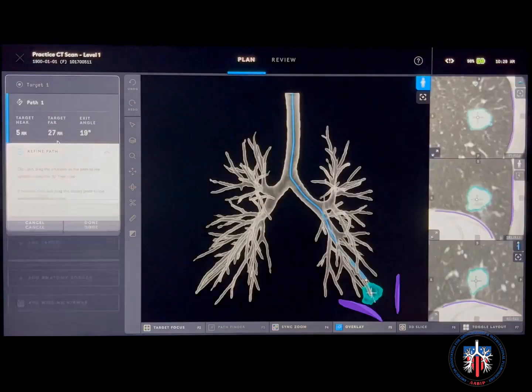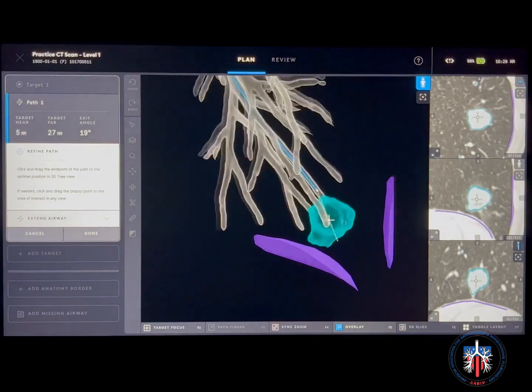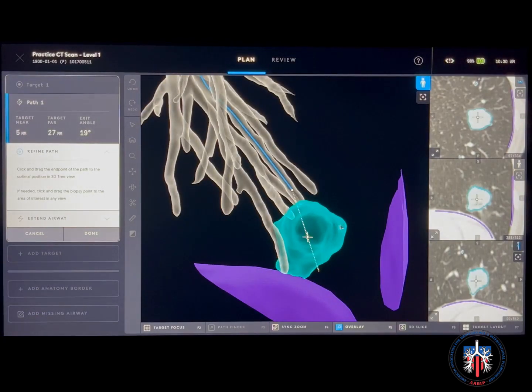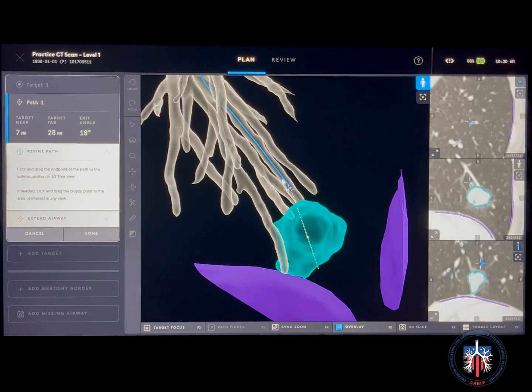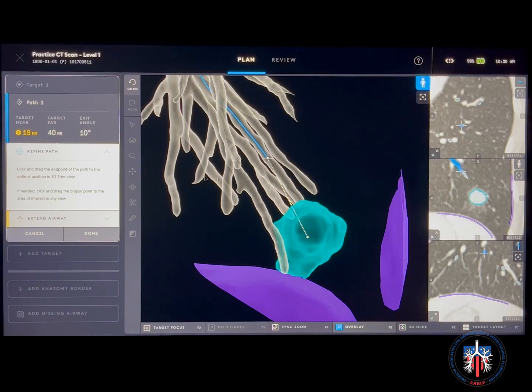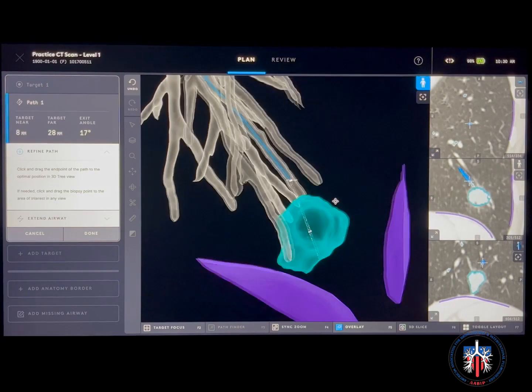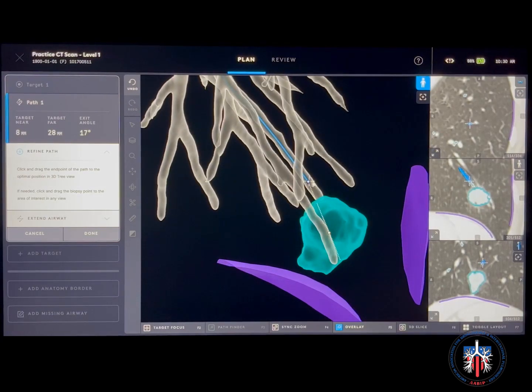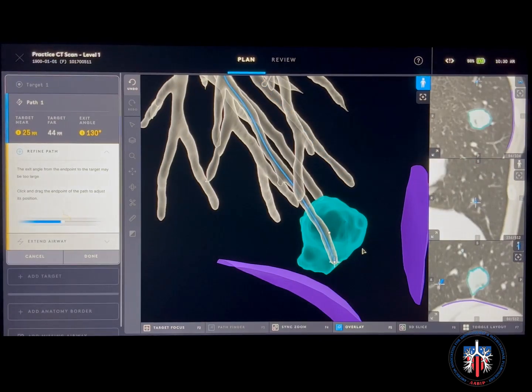Next, click add path and the software will generate the best perceived path to the target nodule, as well as purple anatomy borders based on the nodule's proximity to the pleura or fissure. Review the path and reposition the end point and biopsy point as needed. If the end point is too far from the nodule, the distance will light up in yellow. Similarly, if the exit angle of the instrument is too steep, it will also light up in yellow as a warning.